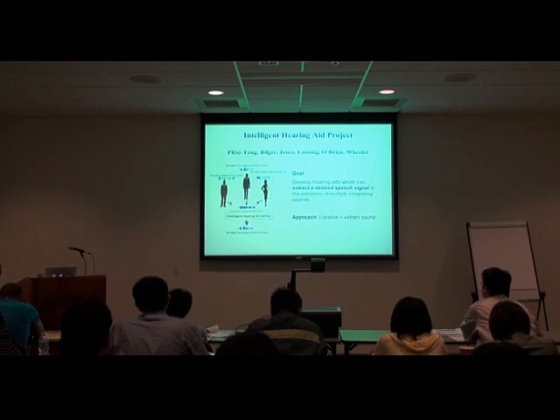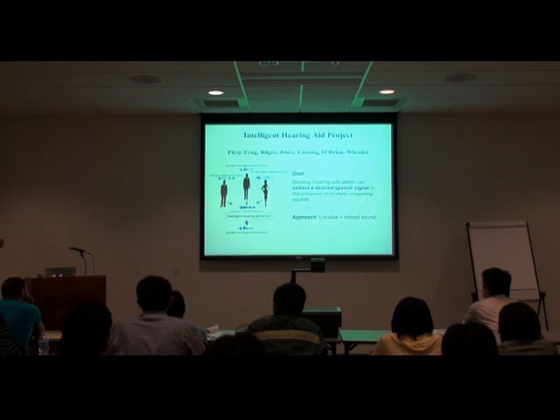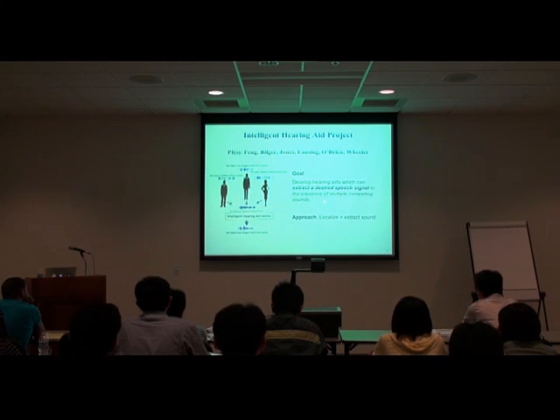So what we decided to do is develop hearing aids that can improve speech understanding rather than the ability to hear. We want hearing aids that can extract a speech signal in the presence of multiple competing sounds.